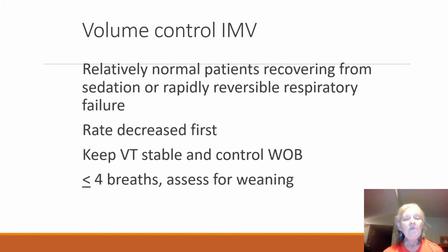Volume control IMV is mainly for patients recovering from sedation or rapidly reversible respiratory failure. What would be a rapidly reversible respiratory failure? Say you have a patient who comes in with an asthma exacerbation, his blood gases are pretty bad. We go ahead and put him on the ventilator.